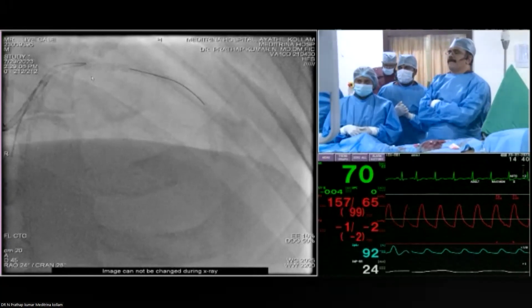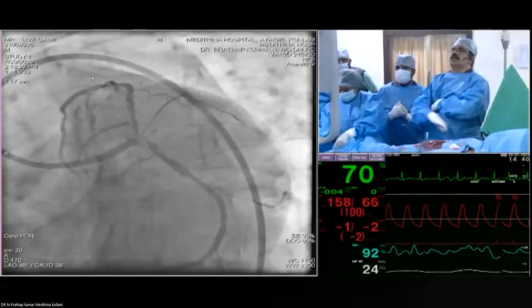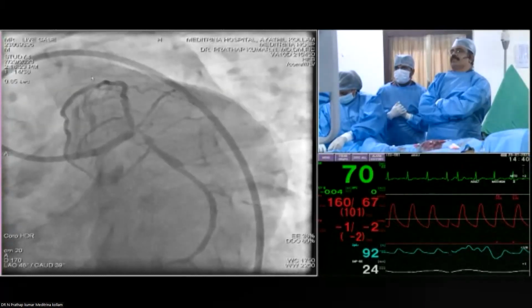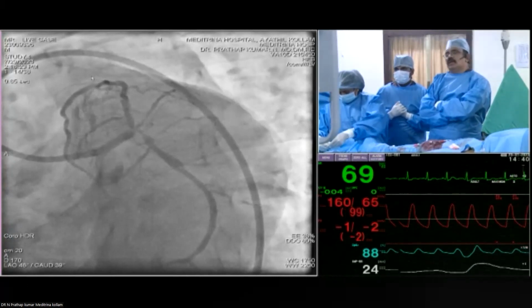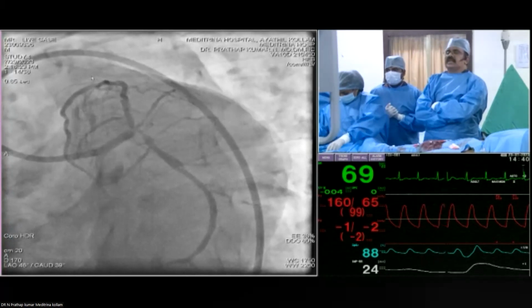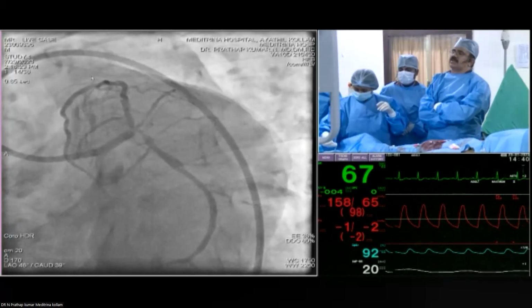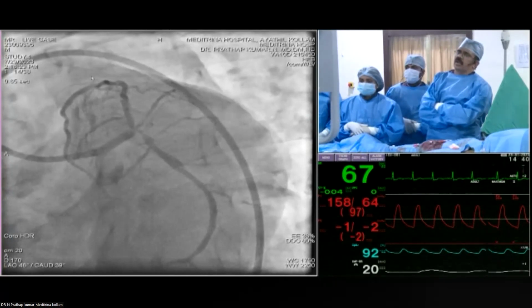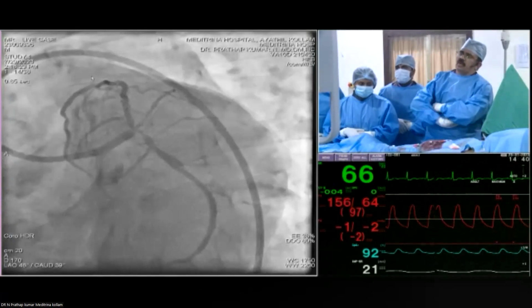What I understood from this presentation is that this is a distal left main situation, and you have to approach it practically. Your plan will be to wire both vessels. Yes, basically we have to wire both vessels, but look at the angulation of the circumflex. You can see it's a very bad angle. It looks like you have to make 2 curves.